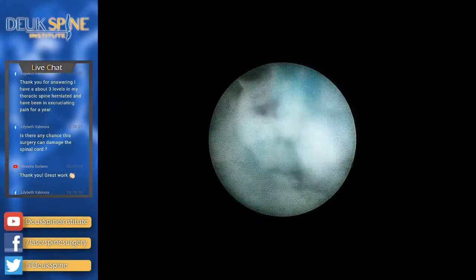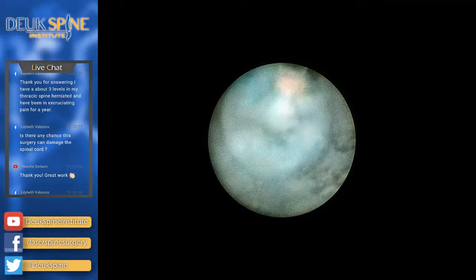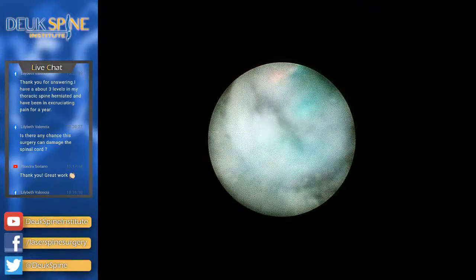No, I'm just kidding. So again, we grabbed a bunch of the herniation with a grabber, but you can still see there's a lot there. So we're just going to have to work it down with a laser.